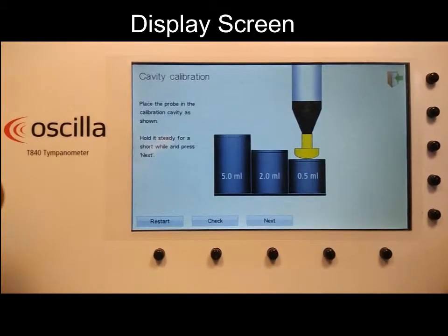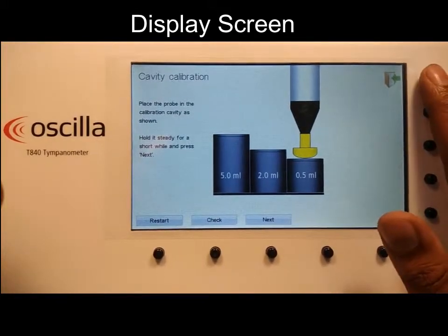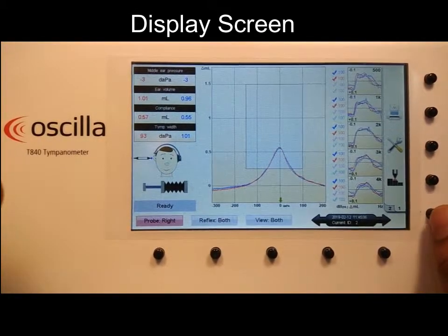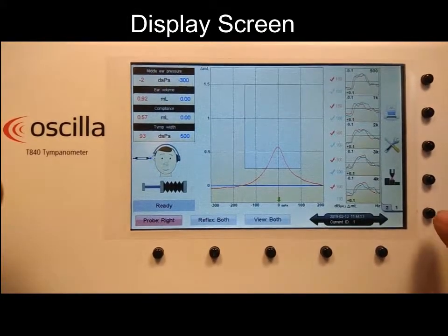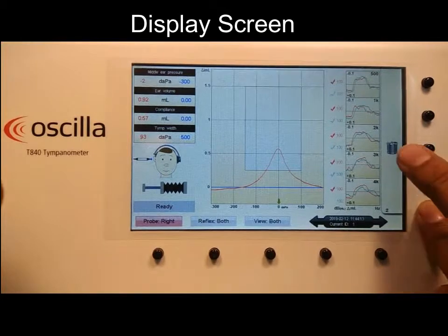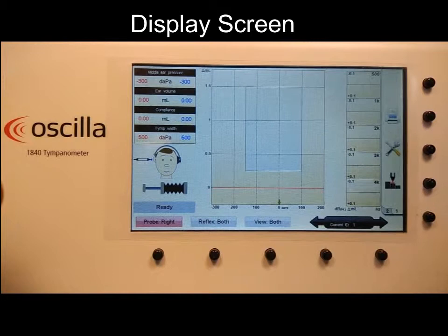When you go back, you can see the calibration menu option — pressing that button takes you into the calibration menu where you can perform calibration. This button, if you want to delete a certain test, hold it and you will see a delete option appear, then press the confirm button and the test will be deleted.